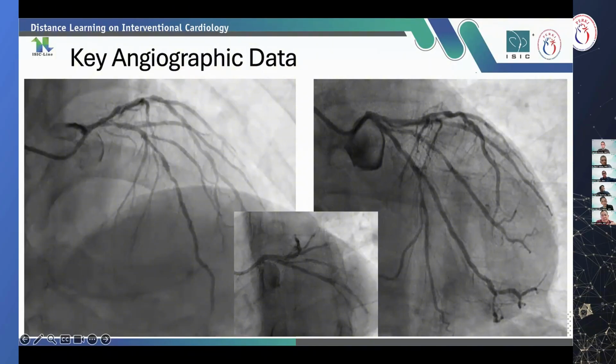If we find there is a pressure jump in one of the lesions, then we need imaging. We need imaging to be certain whether there is calcification or not, because from the angiography alone it is not clear, but sometimes the imaging will be detailed. There is a kind of moderate calcification with the fibrotic and others, so we need a scoring balloon or just a balloon only. Okay, thank you.